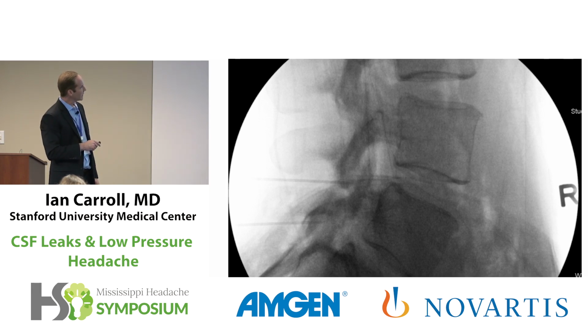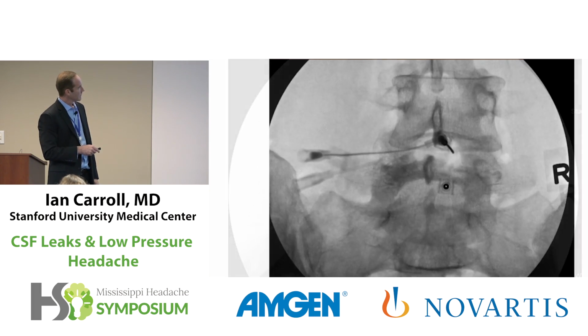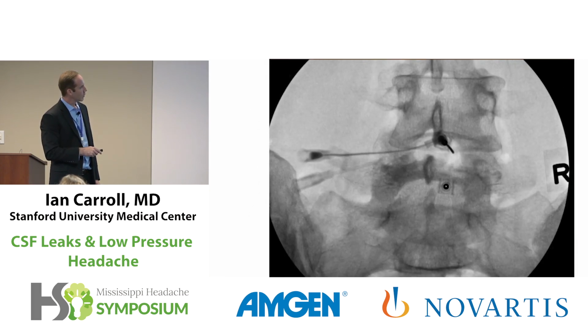Ultimately, what we wound up doing is putting a needle above and below the fracture site, the fracture being right in here on the lamina. That's what it looks like in AP. One needle there, one needle there. The fracture's in the lamina right here on the right. It's on the opposite side now because on fluoroscopy the images aren't crossed.